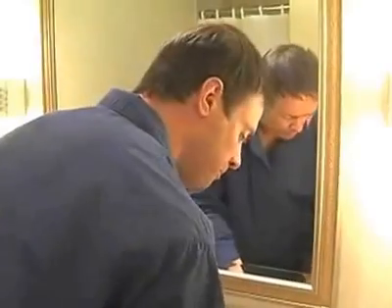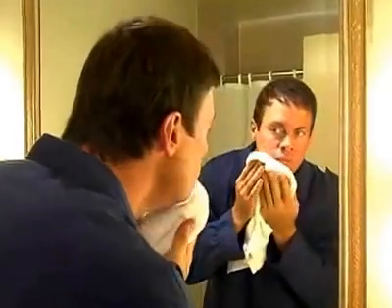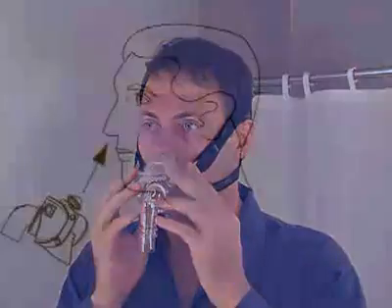For optimal fit, ensure that your face is clean and dry before applying the Hybrid Interface. To fit the Hybrid, pull the headgear back over the top of the head. Next, insert the pillows at an angle into your nose and then rotate the oral cushion downward over the mouth.